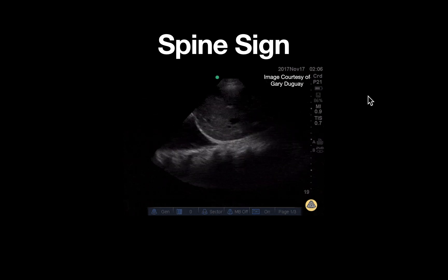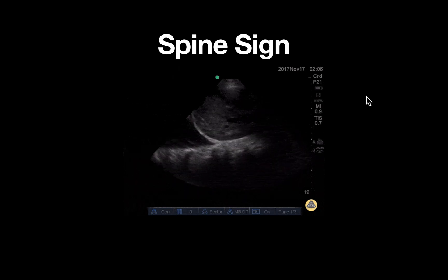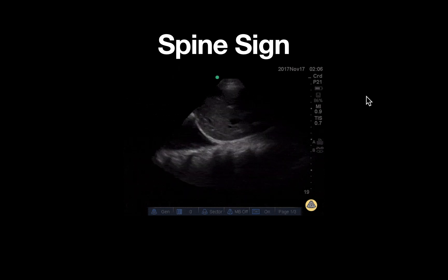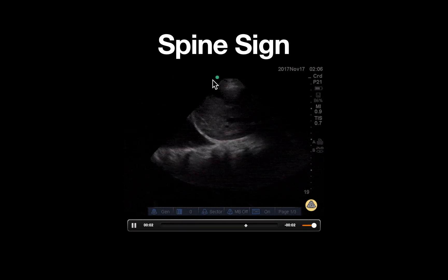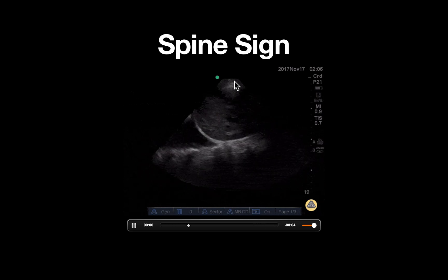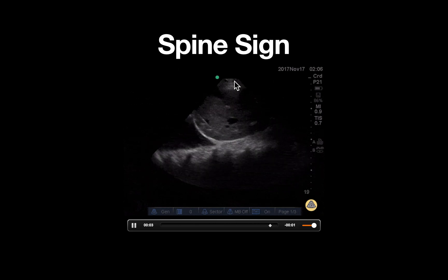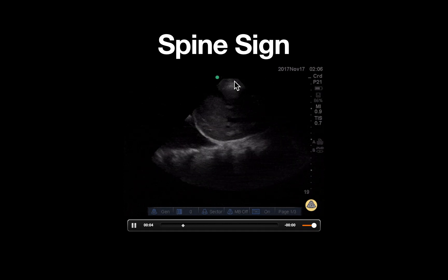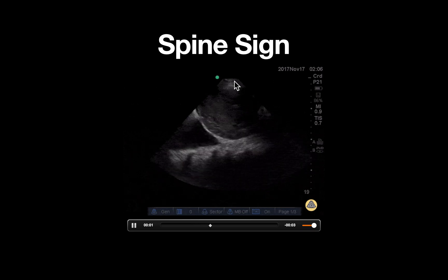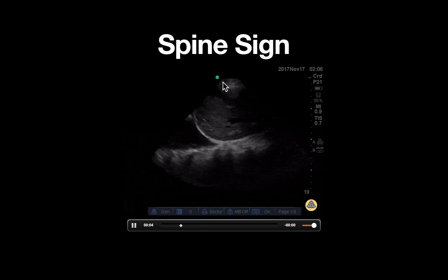This is an ultrasound clip demonstrating a positive spine sign in the setting of a pleural effusion. A phased array probe is used, as delineated by the shape of the footprint at the top of the screen. Based on the structures we're seeing in this image, the probe is placed in a coronal orientation on the lateral aspect of the patient's right chest wall, just anterior to the mid axillary line with the probe indicator directed towards the patient's head.